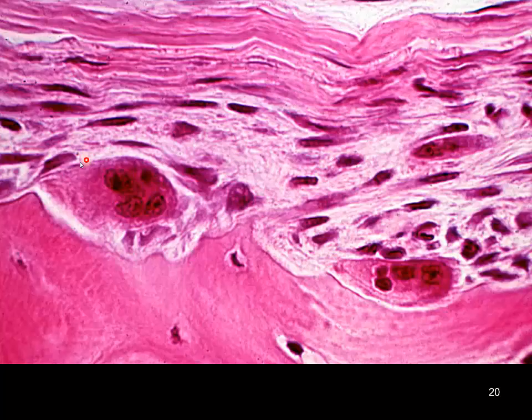Higher magnification, once again, we've got our osteoclast, and I really like this osteoclast, multiple nuclei, but here you can see this shallow depression, almost like a bowl, present here in the bone. This is the area of bone resorption, and this is going to be our Howship's lacuna. Here you can see another depression angled out here, osteoclast. So Howship's lacuna, osteoclast, osteocytes present here. Possibly osteoblast, but being isolated like that, I would never ask you that on a quiz.